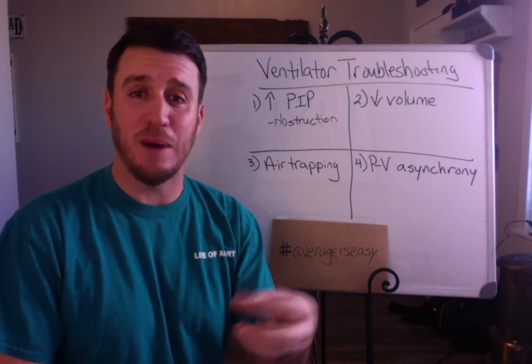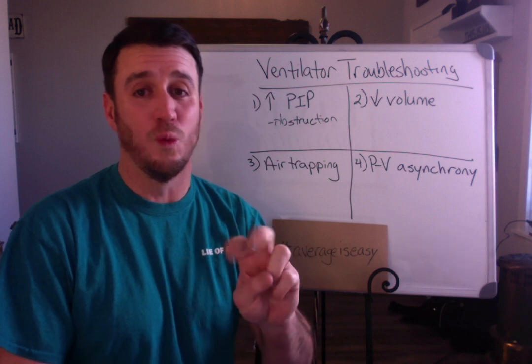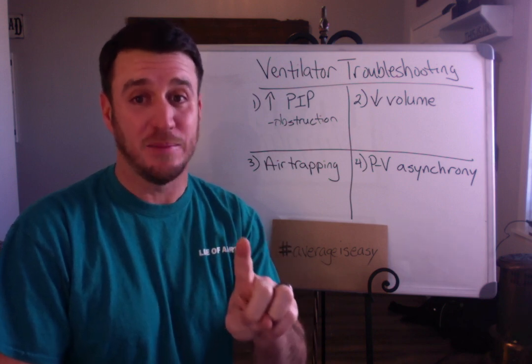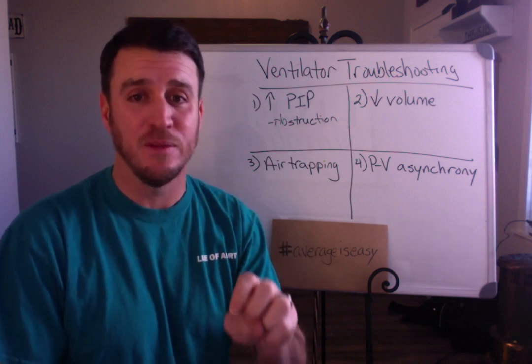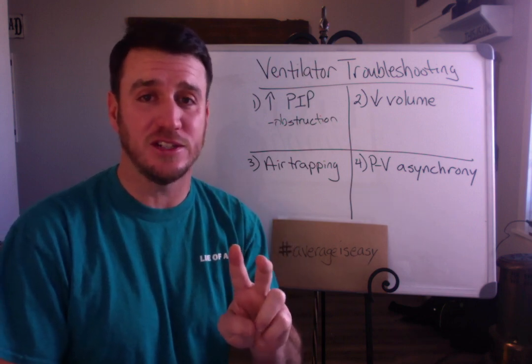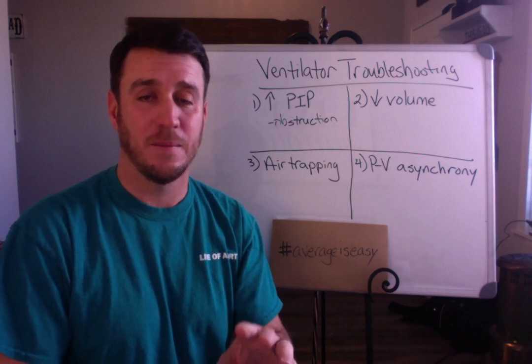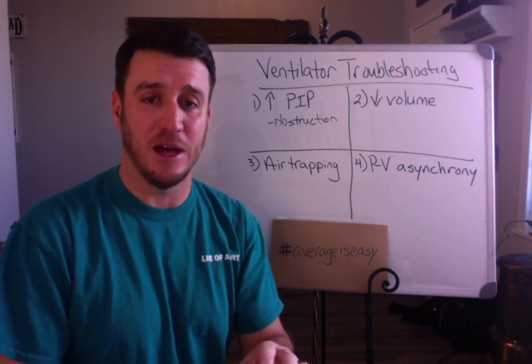For a patient who is biting on the tube, chances are your situation is this. Either one, they're ready to be extubated and you should get them extubated, or two, they need continued mechanical ventilation, and we should probably give more sedation. Okay? So that's my spiel on bite blocks.